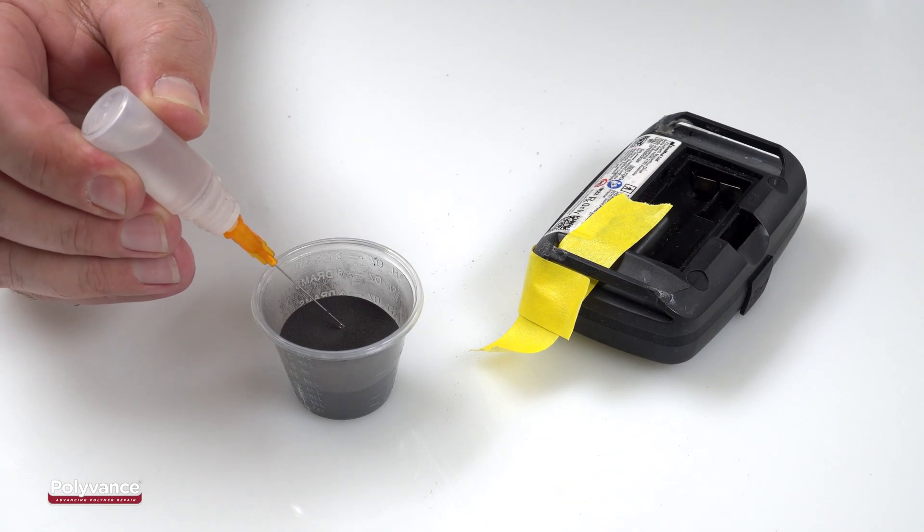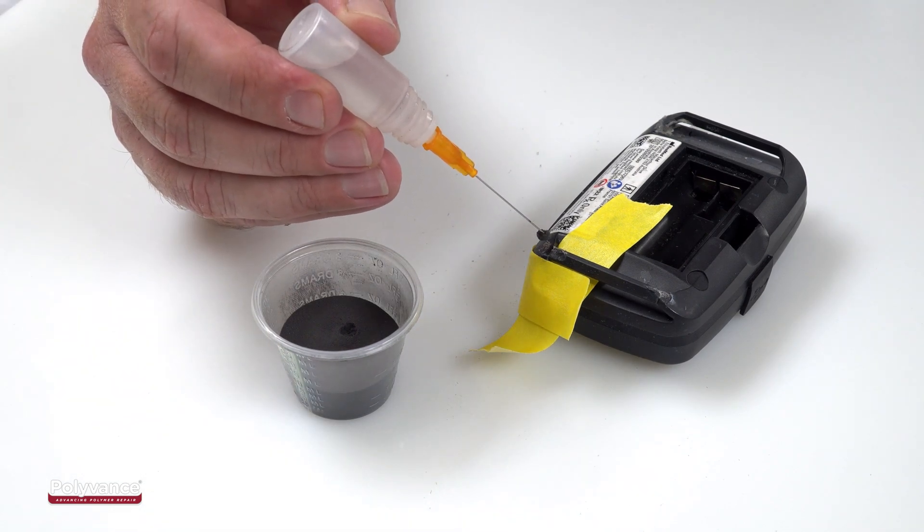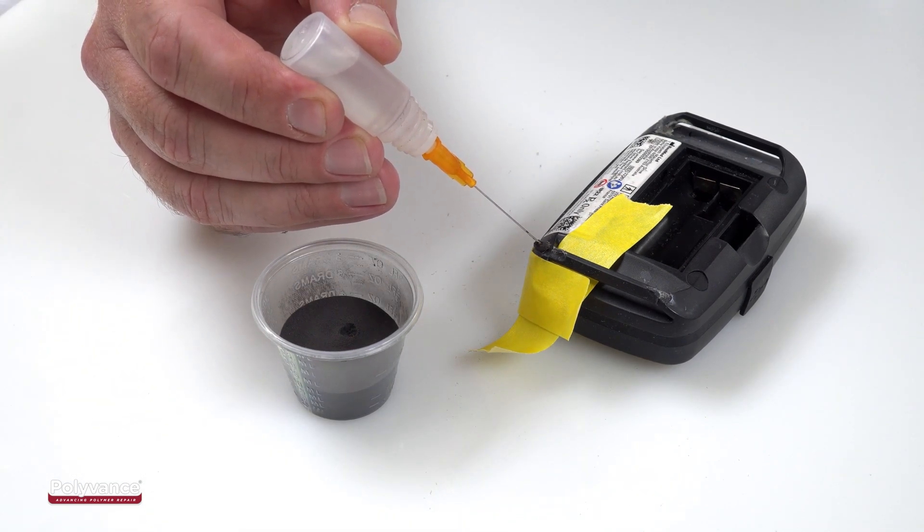PlastiFix can be applied by three different methods, but when you want to place it in a very precise area, it is best to use the dropper method.